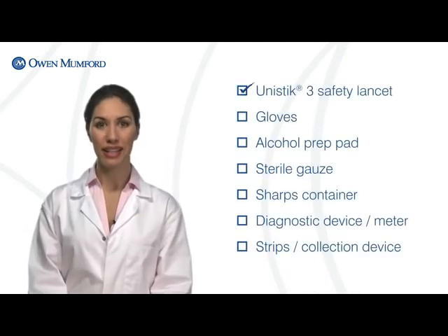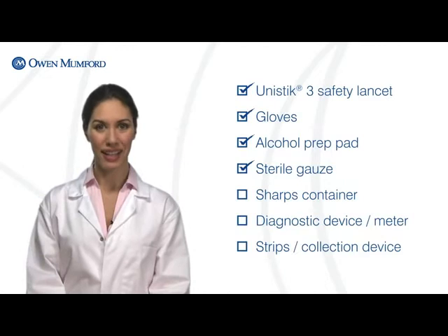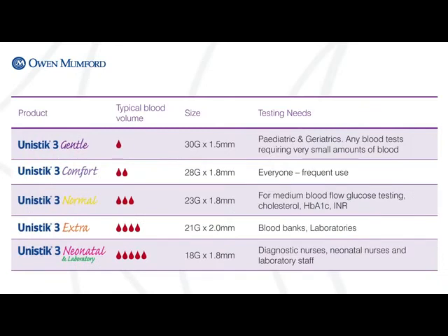Unistik3 makes blood sampling simple and hassle-free. Before you begin, gather all of the necessary tools you will need. When selecting a lancet, it's important to take into consideration the blood volume requirements, as well as the patient's age and other factors that could compromise blood flow such as skin thickness and vascularity.